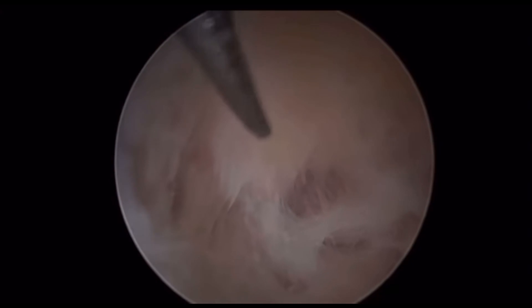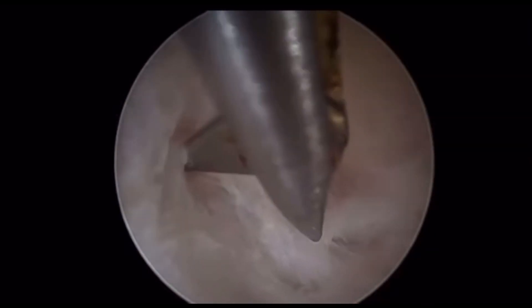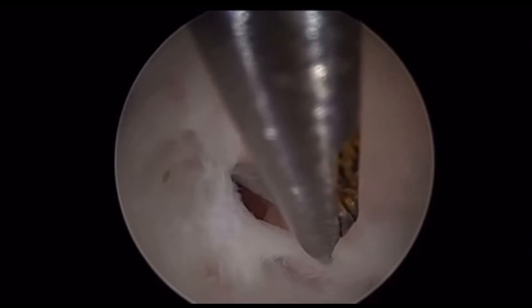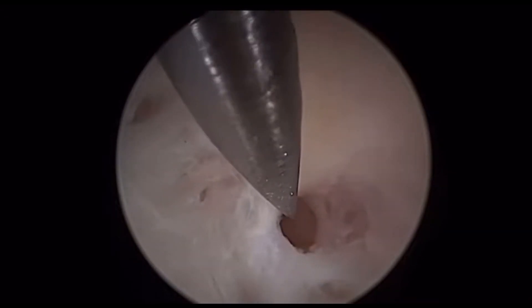For dense fibrosis, hydrodissection is not enough. Watch the beautiful scissors maneuver — look at the movement of the scissor blades, searching, searching — and yes, this black hole identifies the location of the other tubal ostium.